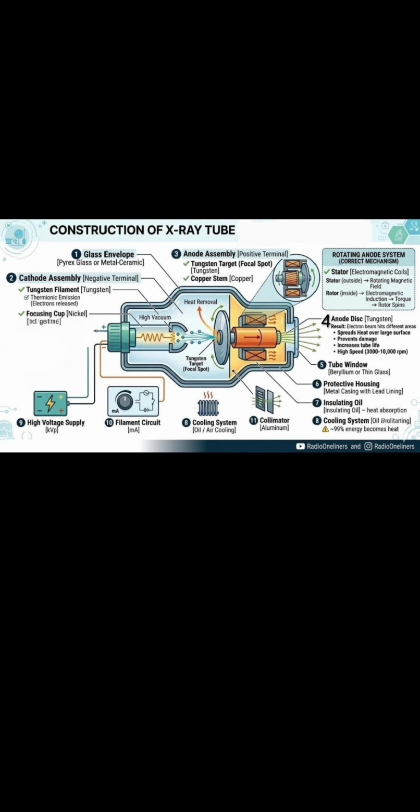First component is going to be the glass envelope, basically the outer covering of the tube. It is going to be made up of Pyrex glass or metal ceramic. It can also be made up of borosilicate glass.